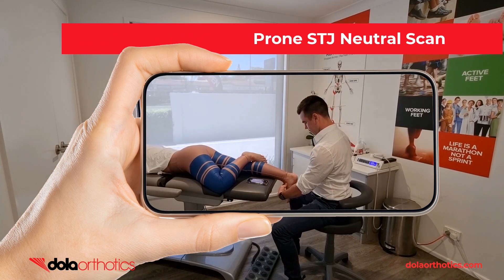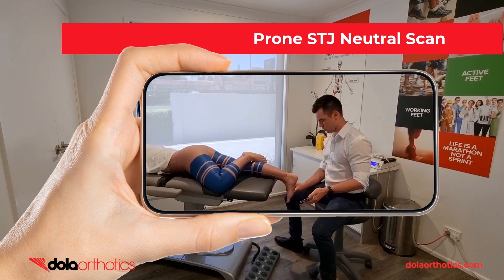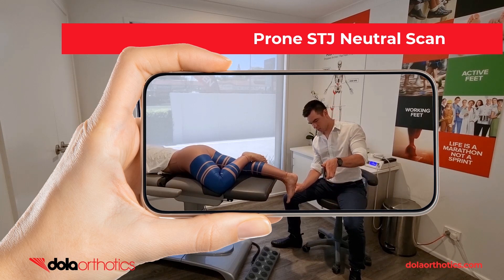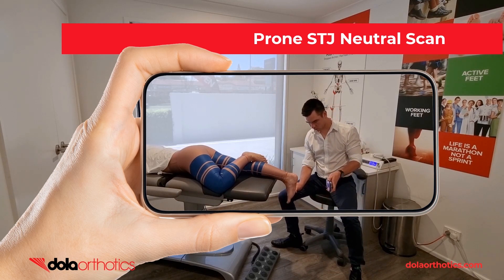Here is a demonstration of the iPhone being used to scan the foot with the patient in a prone position, often seen in a variety of health practices, sporting or gym settings or mobile clinics. The clinician is able to hold the foot in subtalar joint neutral just like completing a traditional prone plaster cast while completing the scan. Move the phone to capture all aspects of the foot including the heel and assess prior to submission.